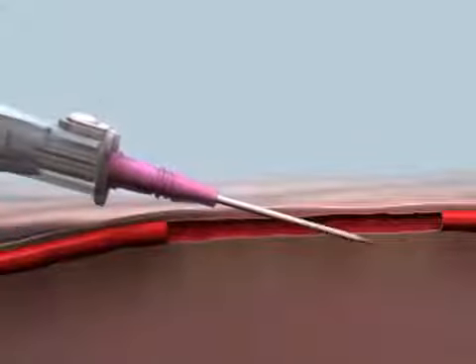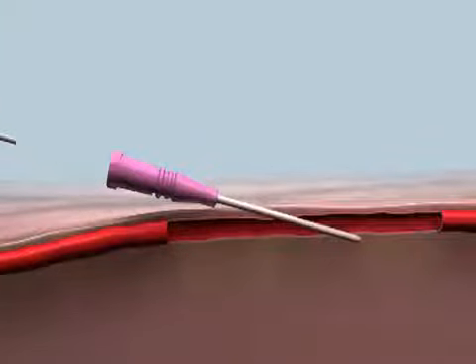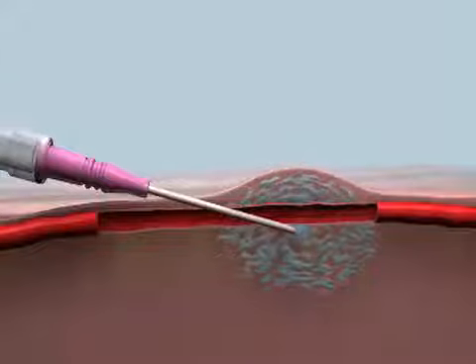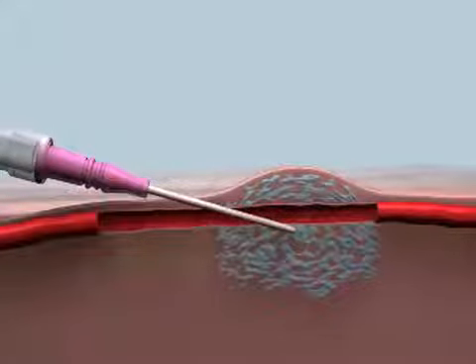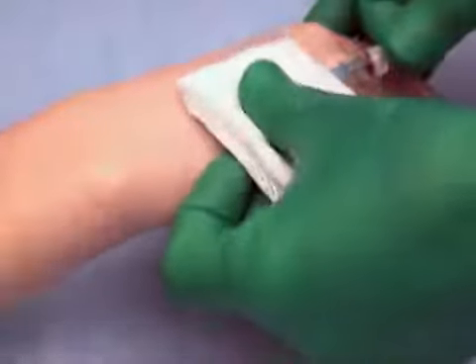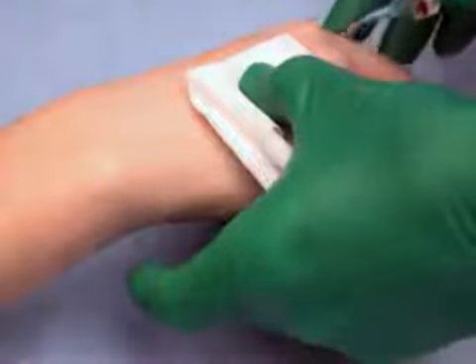Running fluid into the vein may open the valve and allow the cannula to be completely inserted. Occasionally, it is possible to advance the catheter when it is outside the vein or when the catheter has perforated the vein's opposite wall. Either of these situations can cause pain and swelling at the insertion site because the intravenous fluids are administered into subcutaneous tissue. When this occurs, the cannula should be withdrawn completely and another cannula should be placed at an alternative site. When a cannulation attempt is unsuccessful, the subsequent attempt should be performed in a vein proximal to the initial puncture site.